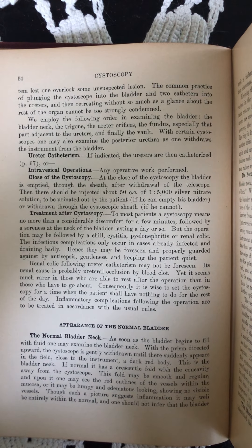Close of the cystoscopy. At the close of the cystoscopy, the bladder is emptied through the sheath after withdrawal of the telescope. Then there should be injected about 50 cc's of 1 to 5,000 silver nitrate solution, to be urinated out by the patient if he can empty his bladder, or withdrawn through the cystoscopic sheath if he cannot.